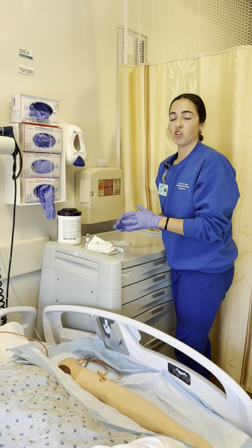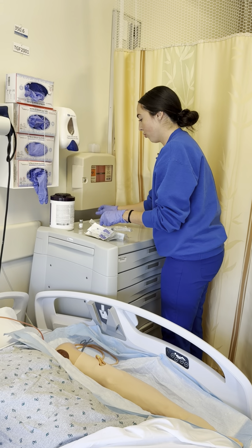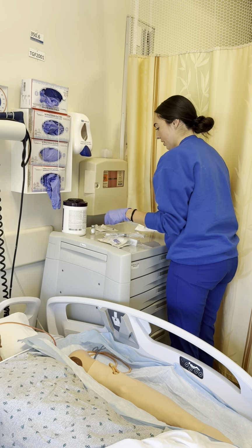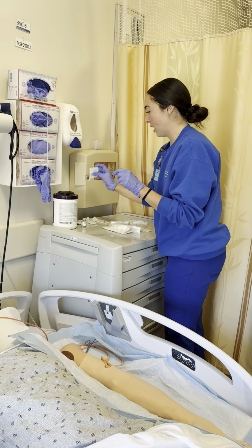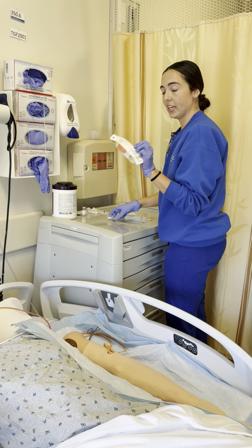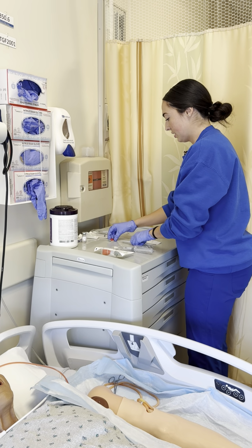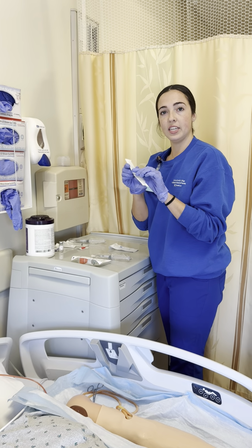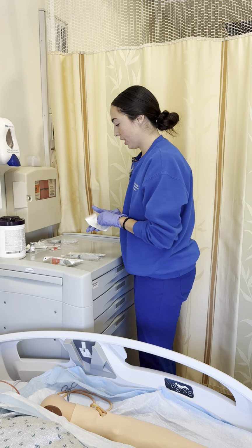So now I'm going to organize all my supplies in the order of use. For the IV, the alcohol pads I won't need until later, but I will need an IV start kit with all of my supplies in there. I'll need a saline flush, my needle, and then my J-loop. So we're going to go ahead and get started.